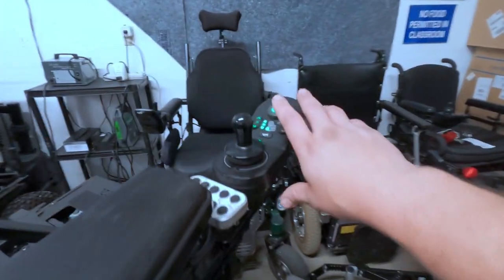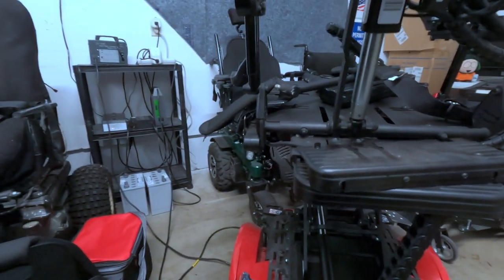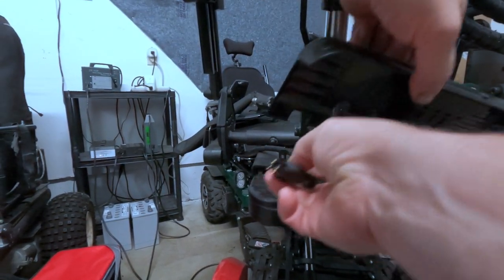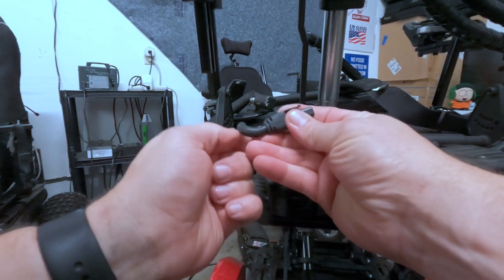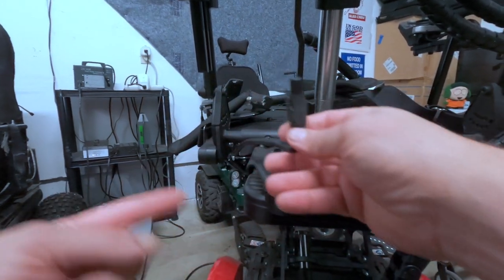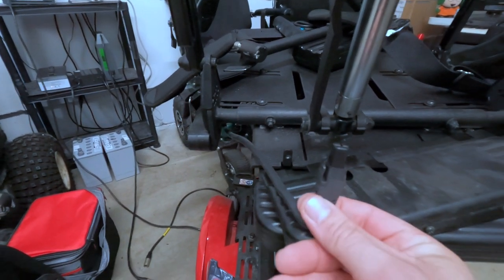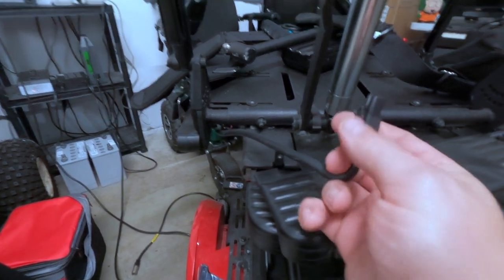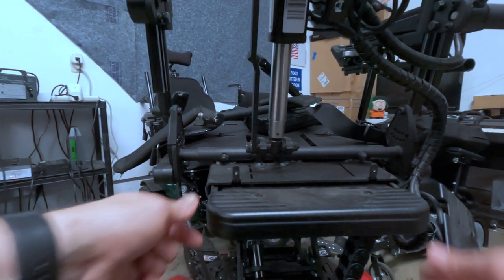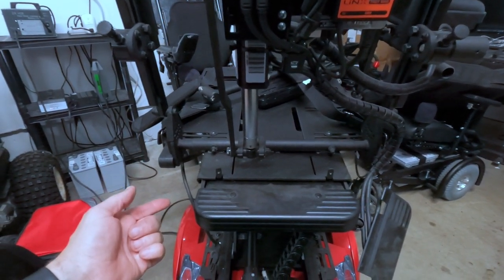I'm not super familiar with dynamic links yet — I'm not sure how the auto-detect stuff works and if you can just unplug things. I do know from my Bounder that you've got to be careful with these little latches, these things will break. I was screwing around in my Bounder which has the DX2 dynamic controls using very similar connectors. I broke one on that. I think that exposes everything we need.